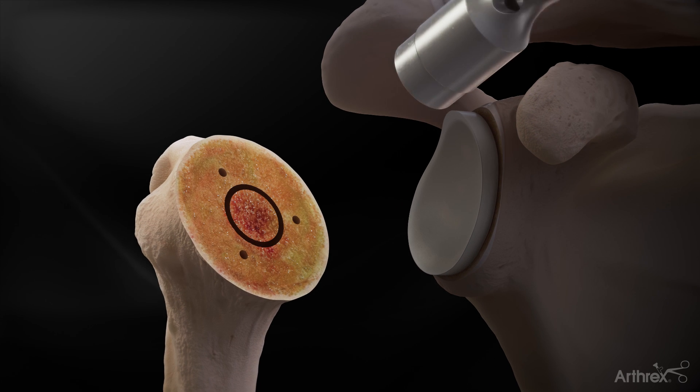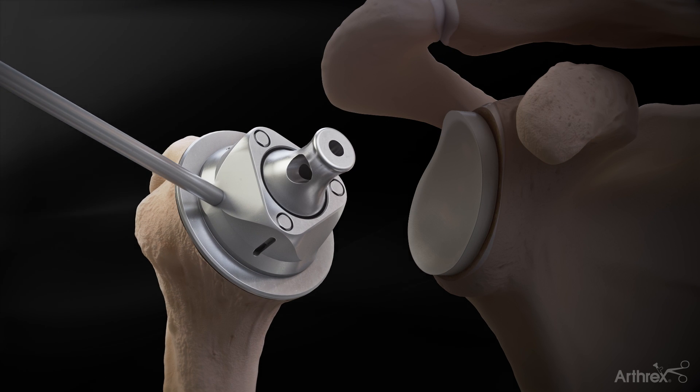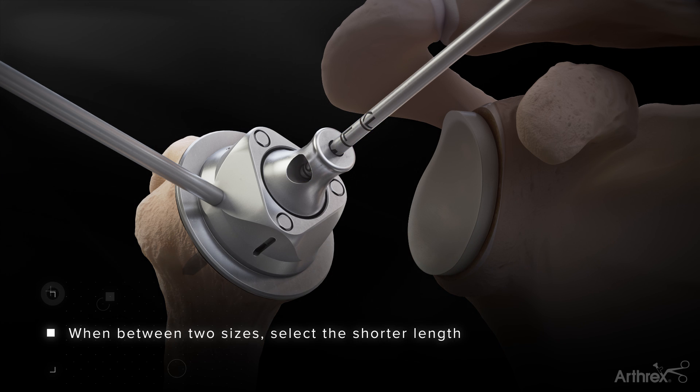Returning to the humerus, the coring template is repositioned and the centering device is placed into the template. The cage screw sizer should be driven through the centering device, taking care to reach but not perforate the lateral cortex. The cage screw size is read from the laser marked lines.